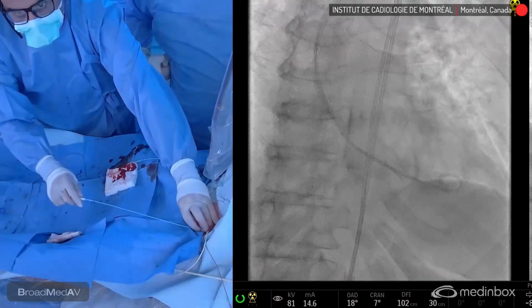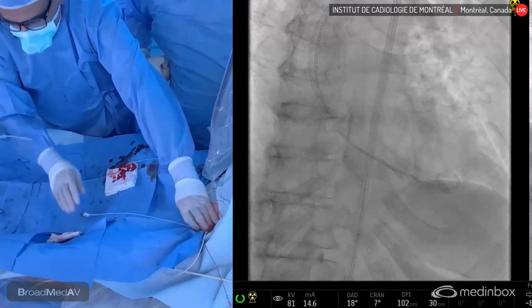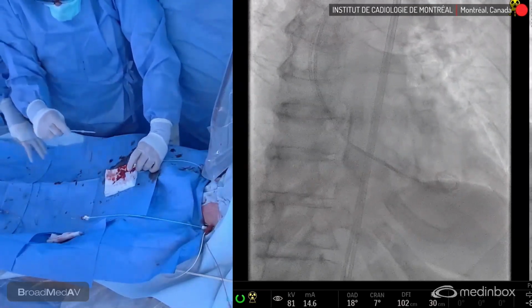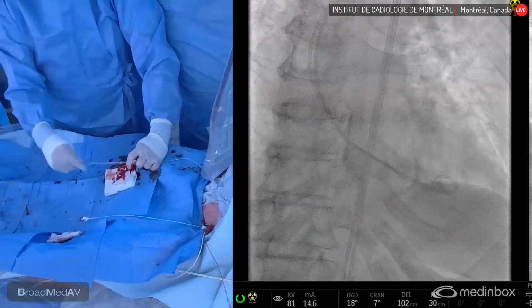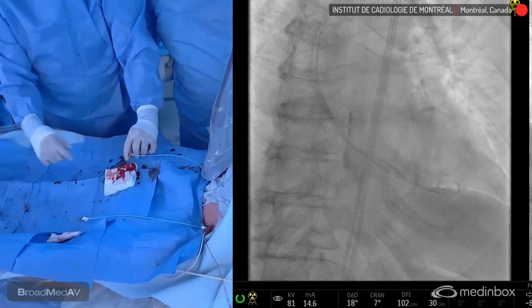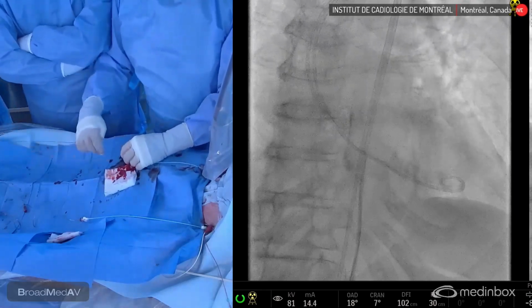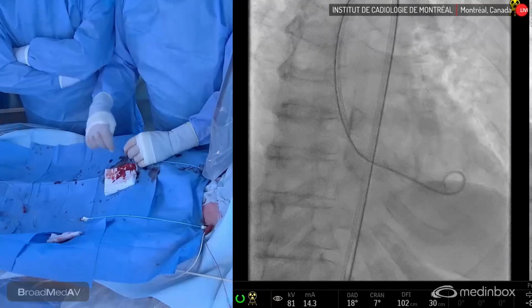As you can see, a lot of the decision making and thought process goes in well before the patient ever gets to the table to try to understand how to manage the coronary disease. We will talk once the valve is in place. You know, what do you do for your antiplatelets? How do you manage that in these patients, particularly with the small valves where there may be a question of early HALT in these types of patients? What's the optimal strategy for anticoagulation or antiplatelet therapy?